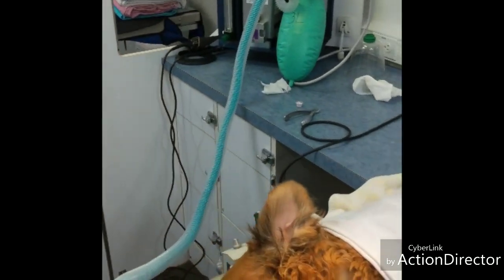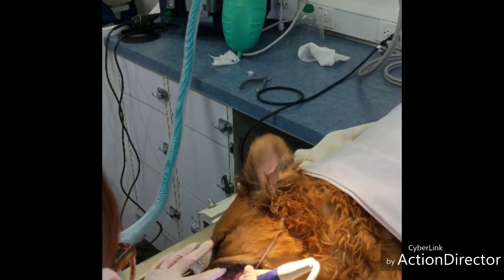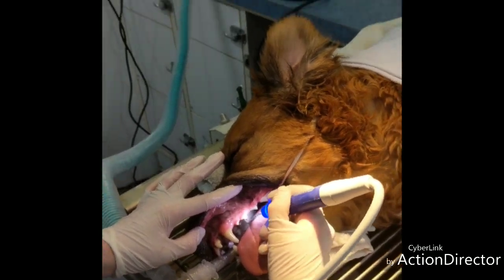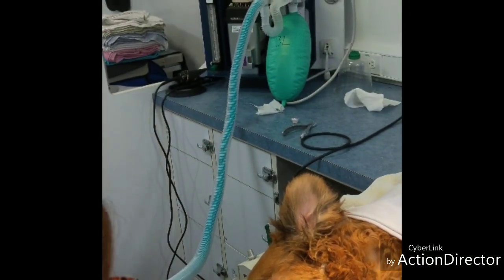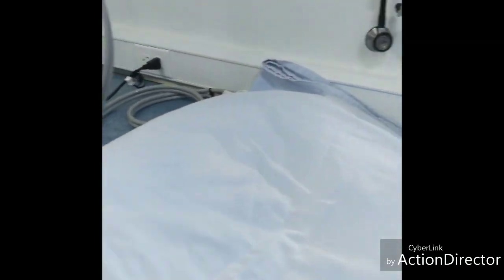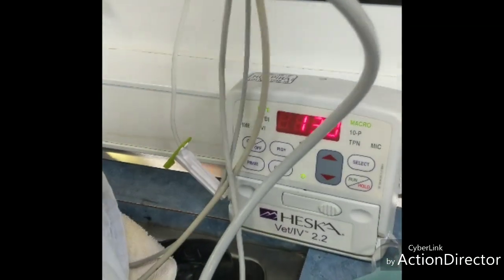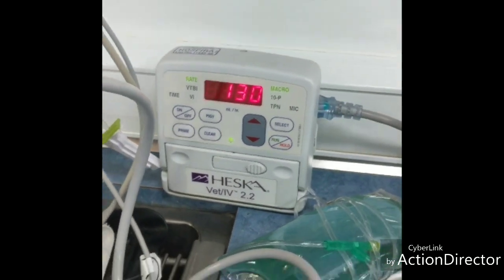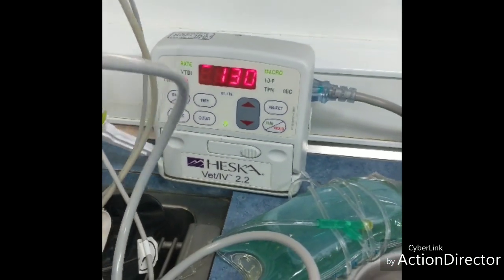This is the anesthesia machine. Much like in people, she has an endotracheal tube going down her windpipe, or her trachea. She connects to the gas anesthesia. This is her IV fluid pump, kind of bogged down in all the wires from her monitors. She's getting warm intravenous fluids into her leg vein.